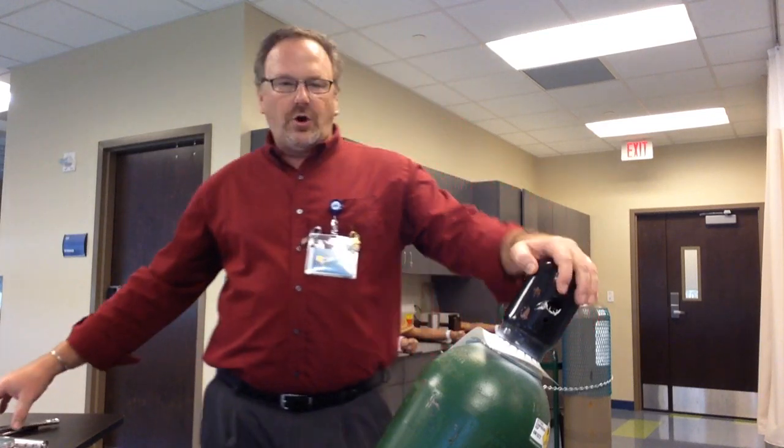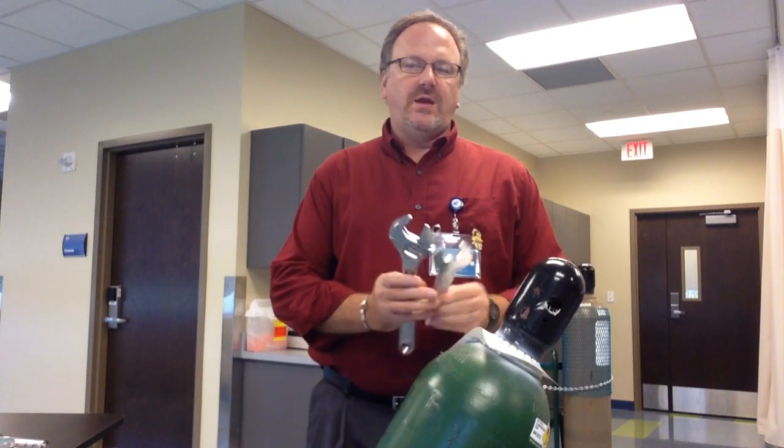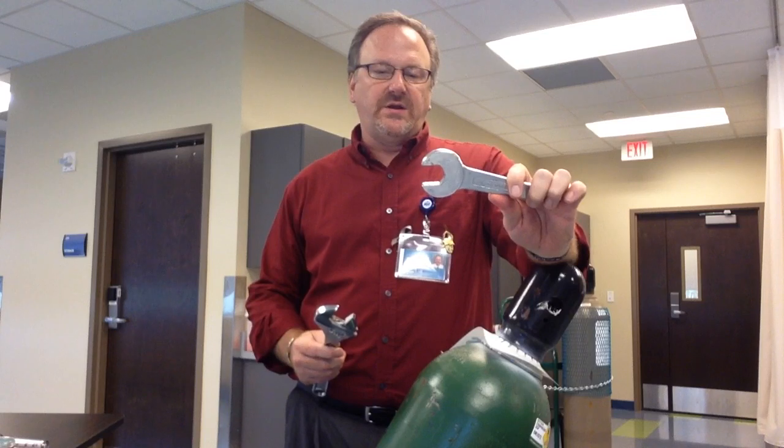We're going to be attaching a regulator to an H-size oxygen tank. There are a few pieces of equipment that you'll need. You'll need a wrench — this one is specifically sized for the oxygen regulator.